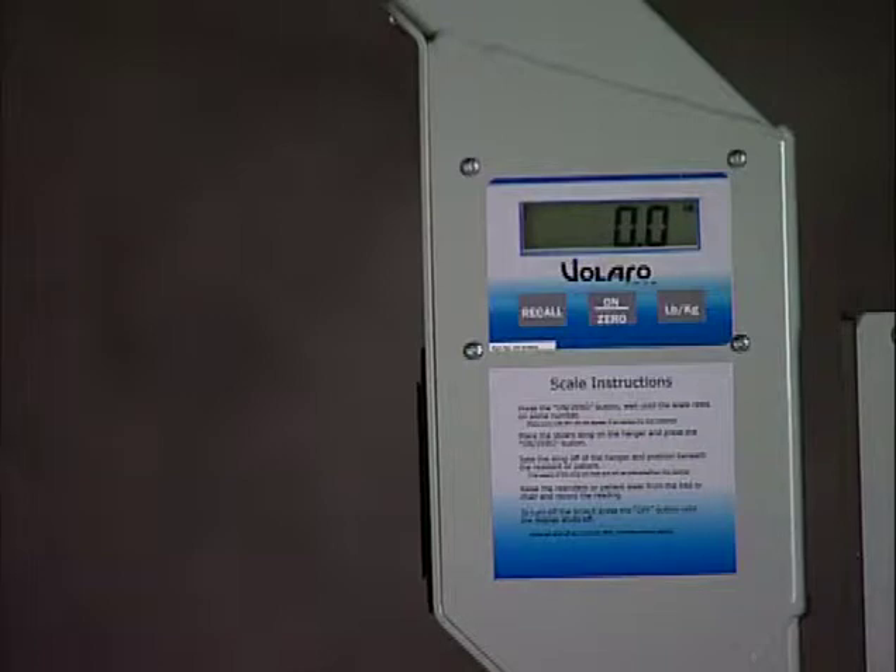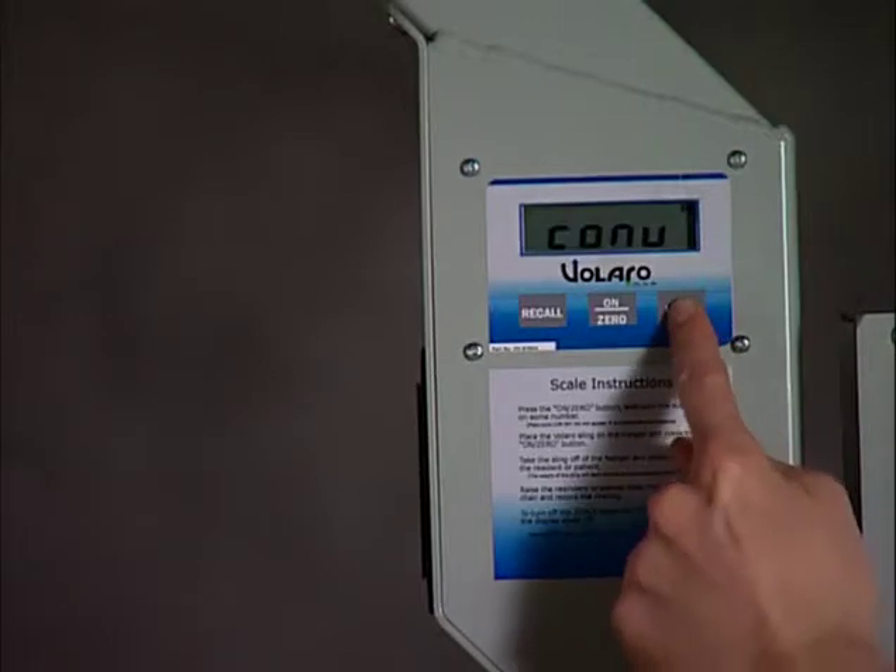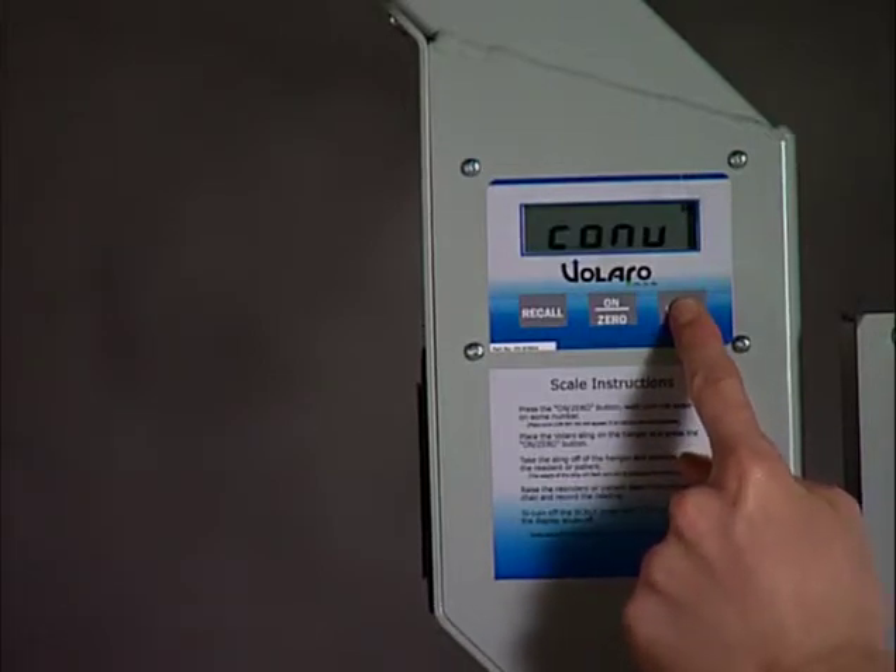After 0.0 appears in the display, you may select the unit of weight desired. To toggle between pounds and kilograms, press and hold the pound-kilogram button until CONV goes off the display, then release the button.